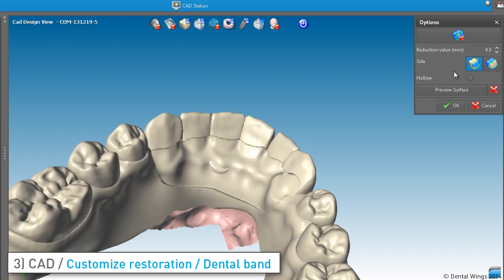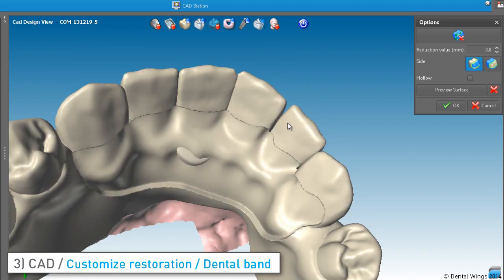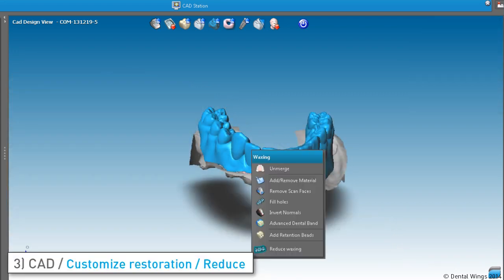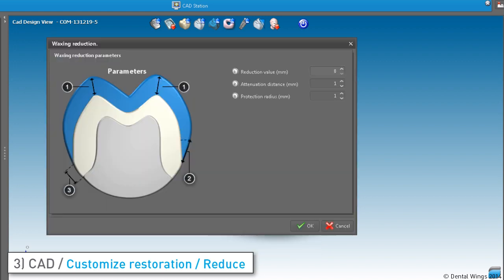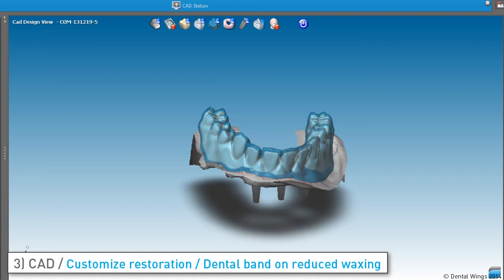On the other hand, if you select the inside icon, the line you draw circles the reduction. By using the Reduce Waxing feature, you can easily prepare a substructure by applying a global reduction parameter. Set its height right here. You can leave the other parameters with their default values and adjust them afterwards if the result is not satisfying in the margin area. You can still see the full anatomy waxing in transparency, and the overlay is also displayed.